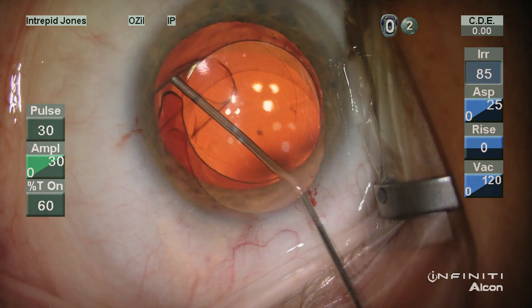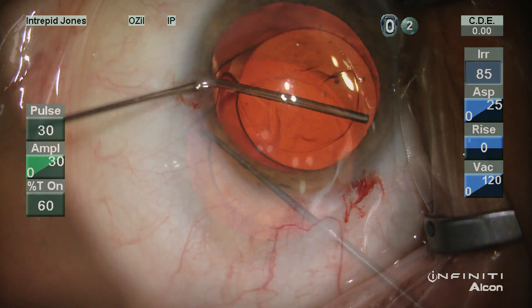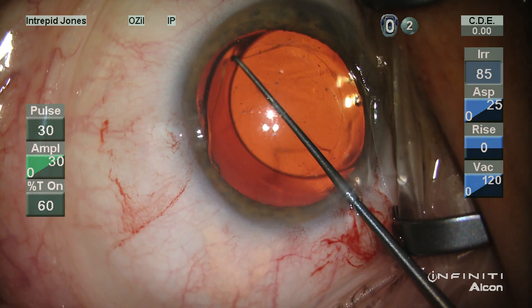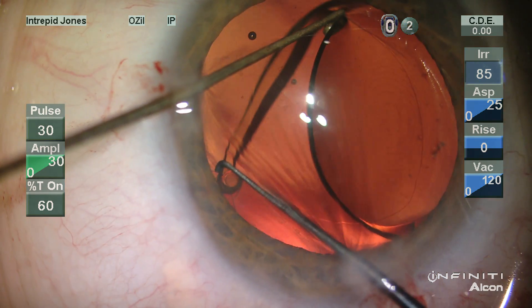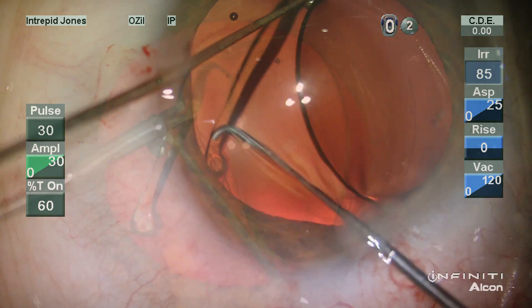In this case, seven months post-op from Restore implantation, distance uncorrected vision was good at 20/20 and near vision was 20/30 uncorrected as well. However, it was apparent that this lens was not well centered as it was decentered relative to the undilated pupil.